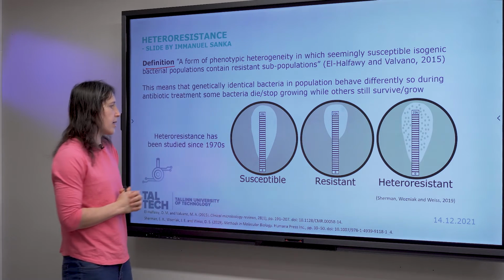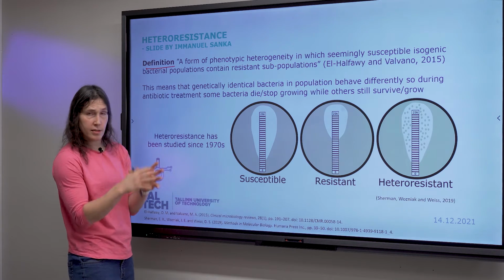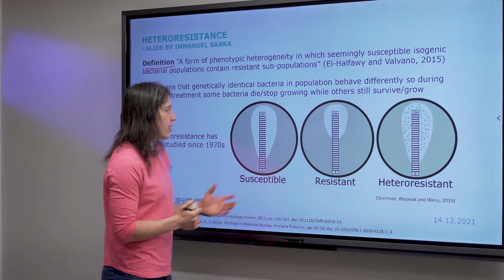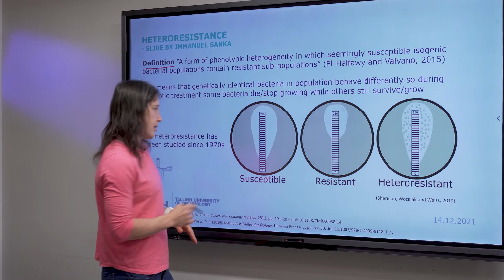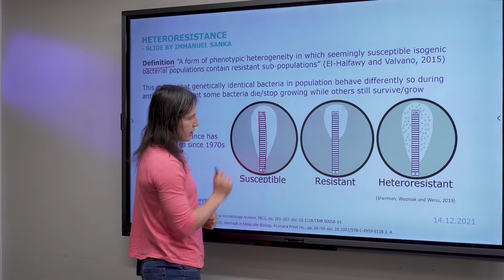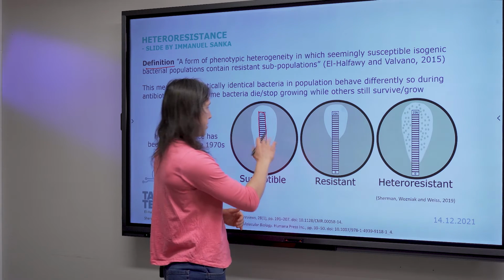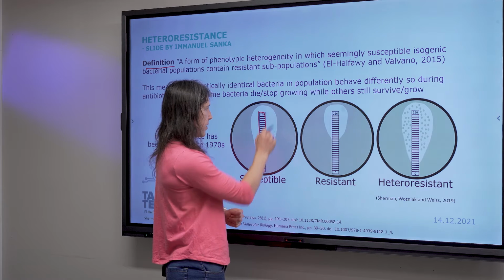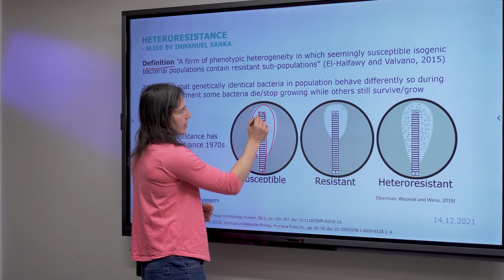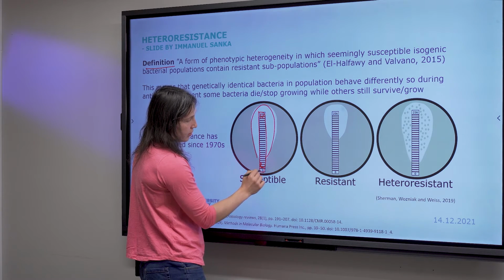So in the 1970s, studies used plates, which are still used to this day. They looked at it like this: you have this strip with an antibiotic concentration, and then you have a susceptible area of bacteria around it. This is the highest concentration of the antibiotic, and this is the lowest, or 0, basically.